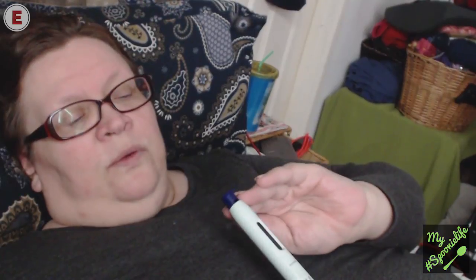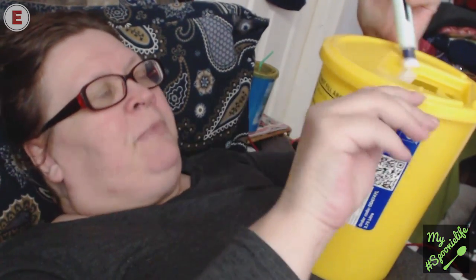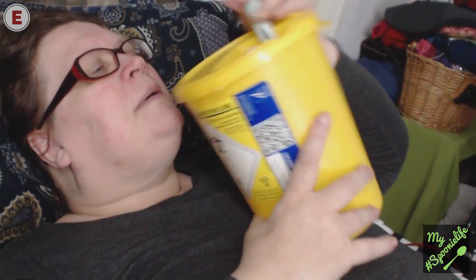Now, important — there is a very sharp needle in there. It is protected, kind of, but a child or someone curious might try to fiddle with it or stick their fingers in there. So I put the cap on like that, and I put my used injections in here. They actually come to our house to pick these up and take them away to be destroyed.